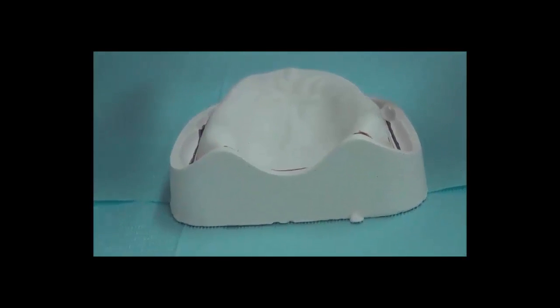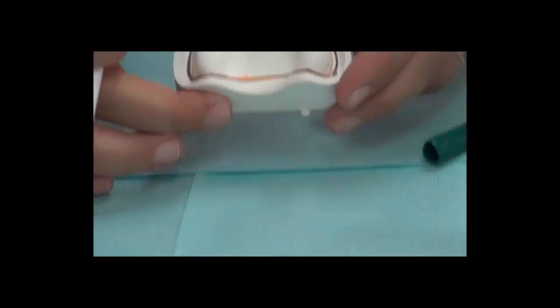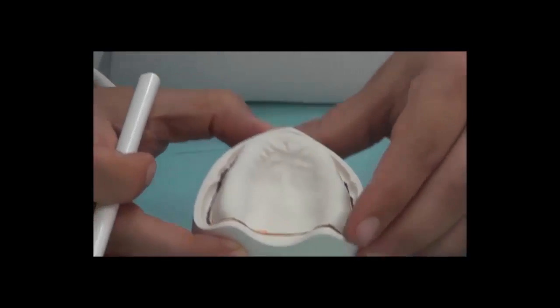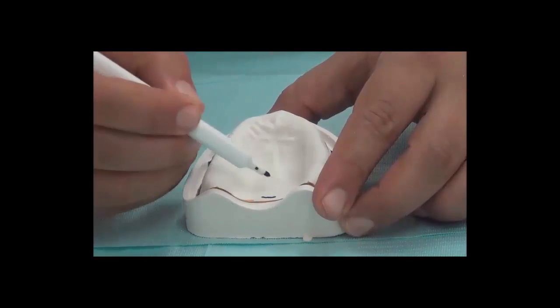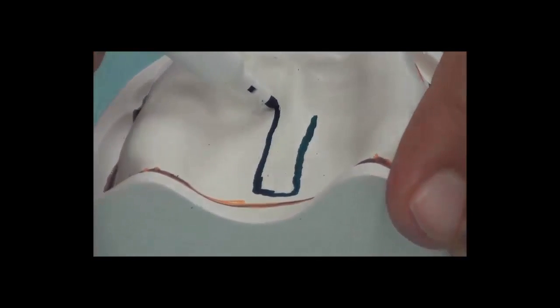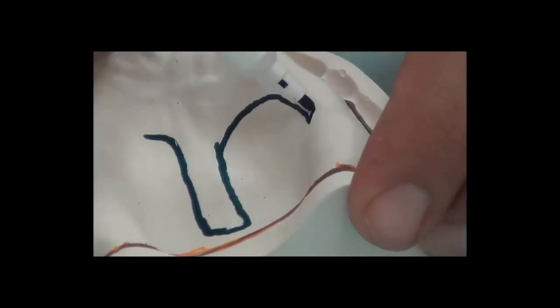The third step is we draw the outline of the spacer. And here we're following the partial spacer shape. So we're going to add the lines over the areas that we should be relieving. So the mid-palatine suture, just revising them, the rugae area, the crest of the ridge, up to the tuberosity. We exclude the tuberosity.